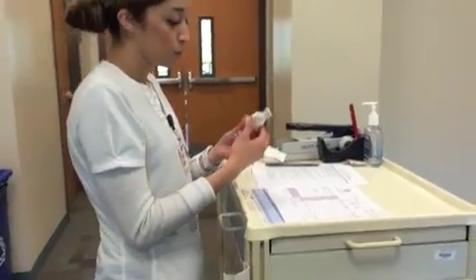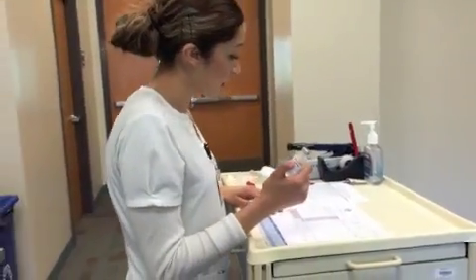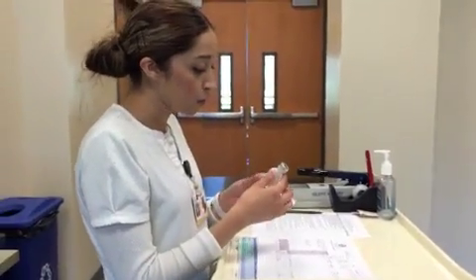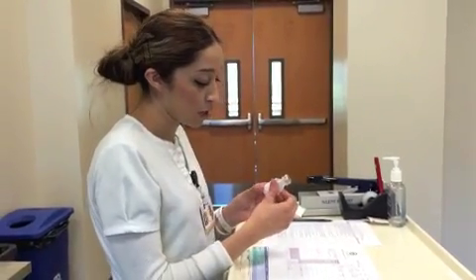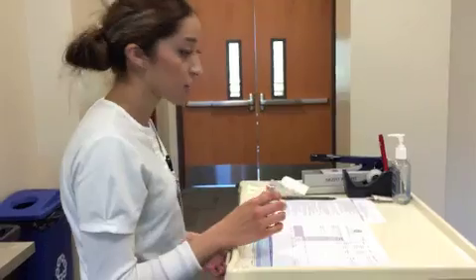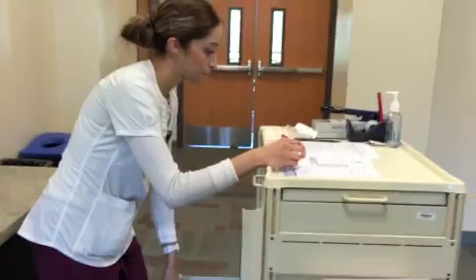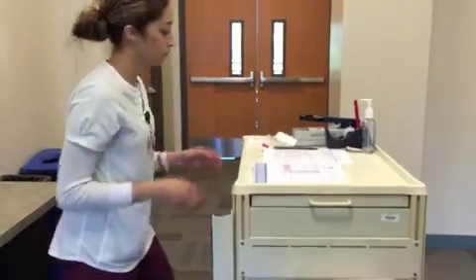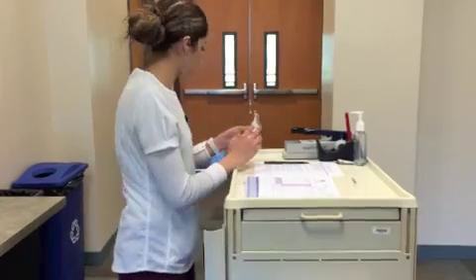So second check would be, again, the right patient, Smith, Clara, the right drug, which is a PPD, the right dose, which is 0.1 milliliters, and the route would be intradermal, and the time will be right now. You want to throw all your supplies away.